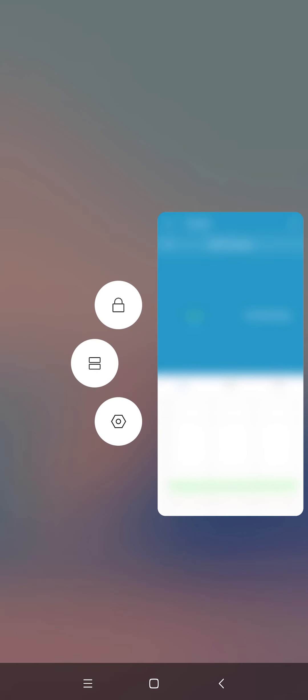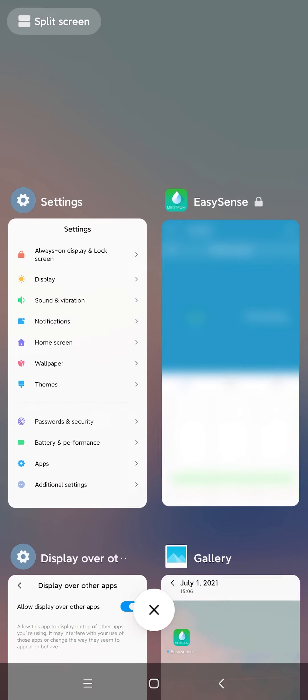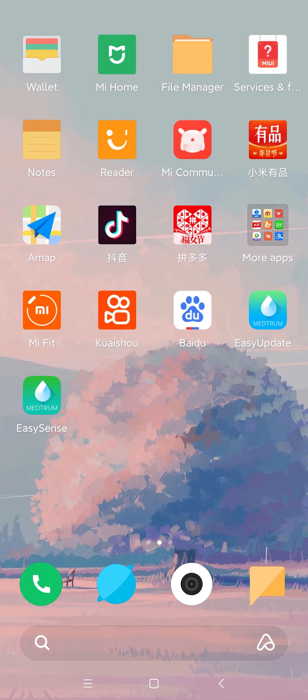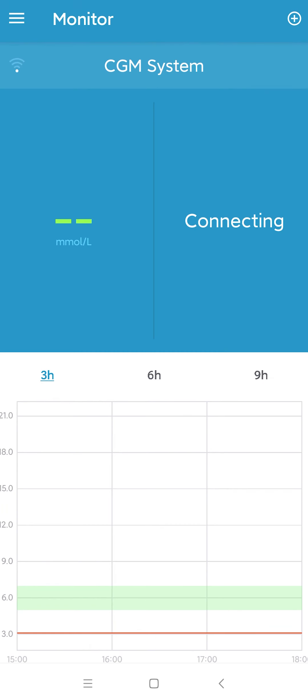Lock the EasySense app in the background by pressing the Lock icon.